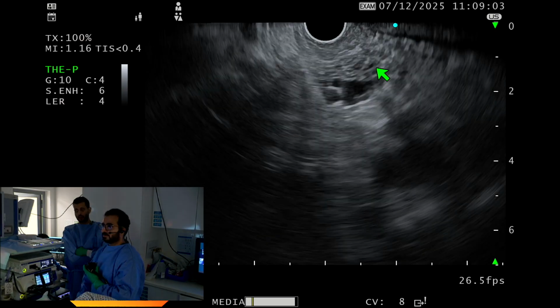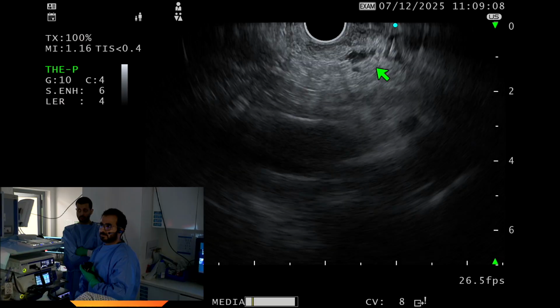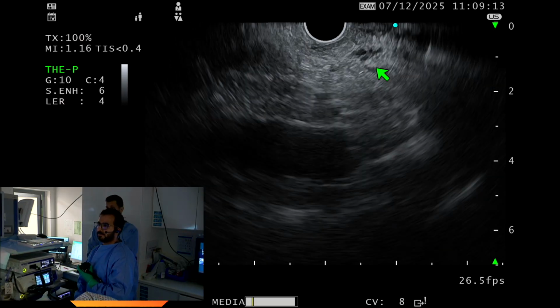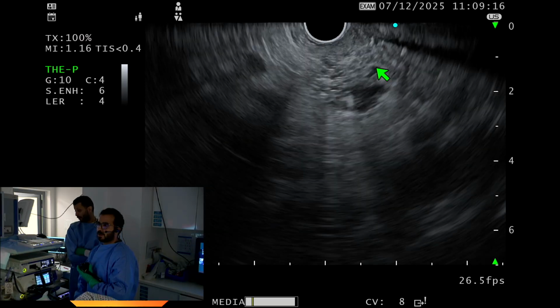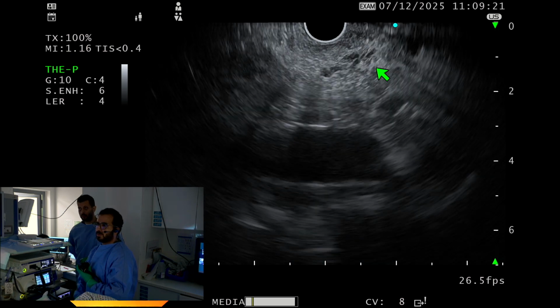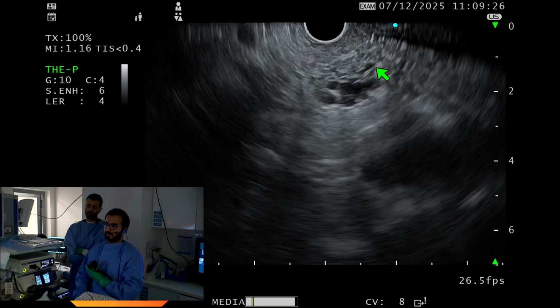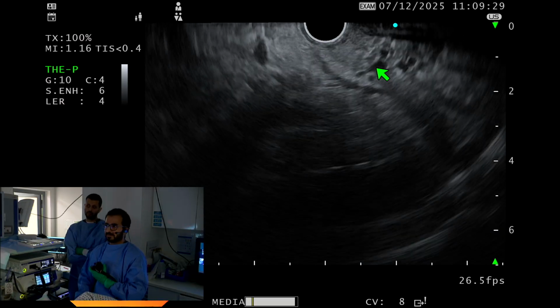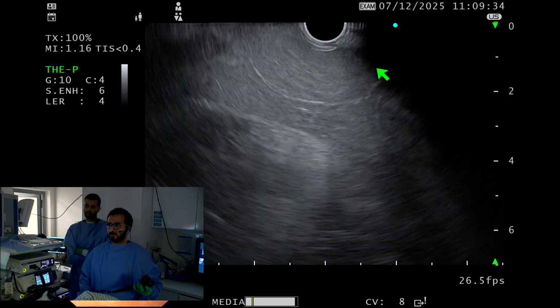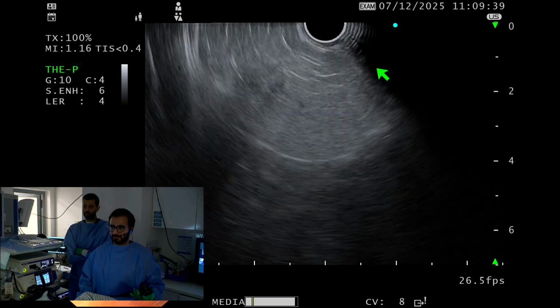Yeah, I agree. So, first of all, very excellent demonstration of EUS. What machine are you using? What scope are you using? So we're using the Olympus Mu3 EUS. The new Mu3. Very nice. The images are coming through very well, although I'll make a comment that if there is one endoscopy procedure in a live endoscopy forum where the two of us are commenting on it, the EUS is one exception where only the operator really knows best what they're seeing.